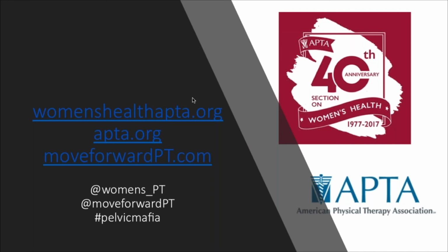It's a good assessment from an orthopedic standpoint to determine whether these muscles can activate voluntarily, and whether patients have difficulty cognitively contracting when you have them purposefully try to contract, versus when you have them do a different activity where they're not as cognitively aware, and does the pelvic floor or transversus contract? So it gives you information on involuntary and voluntary contraction capabilities of the muscle as well.